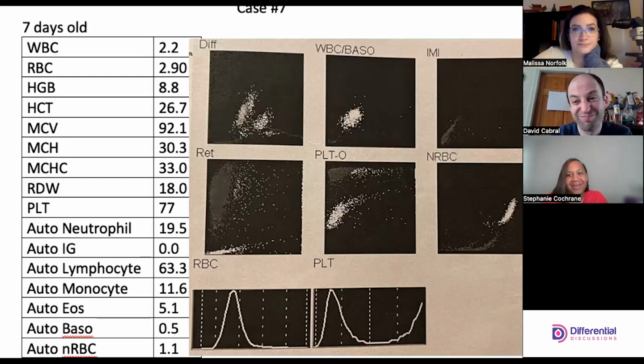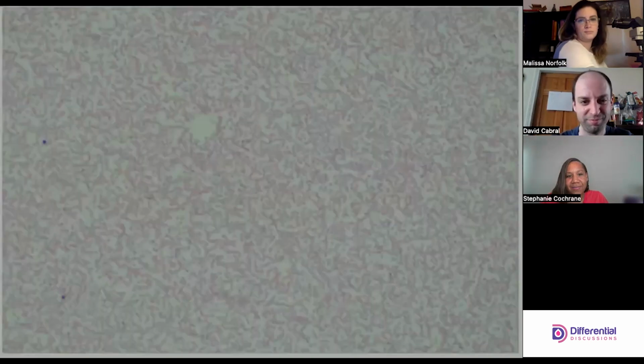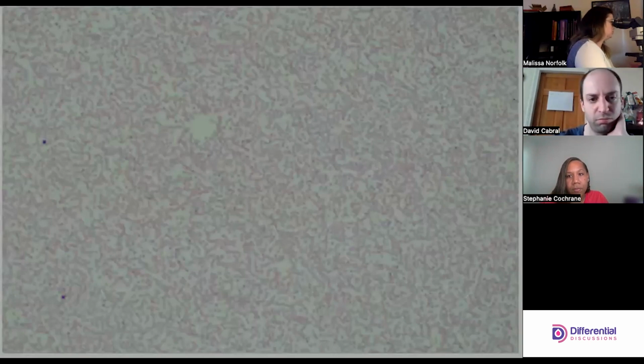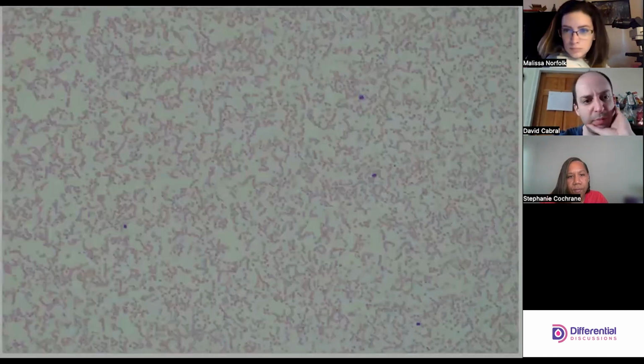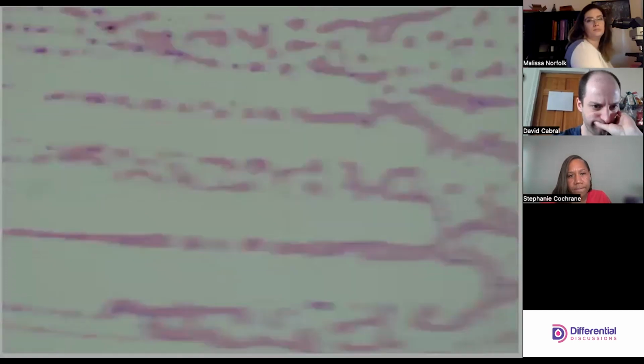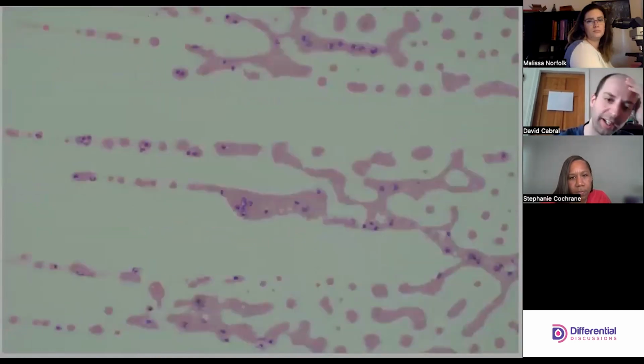So is it slide time? Yeah. So there look like some pockets of, I don't know if there's agglutination or if it's just area, but let's move a little thinner here. And maybe we can look at the feather a little bit too, I guess. I don't see anything standing out at the moment.